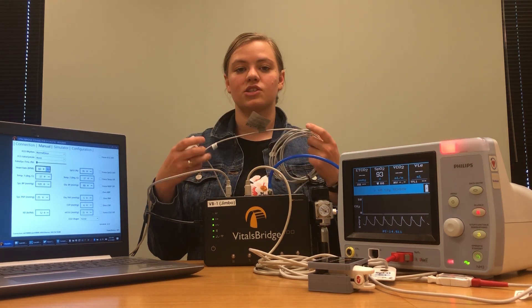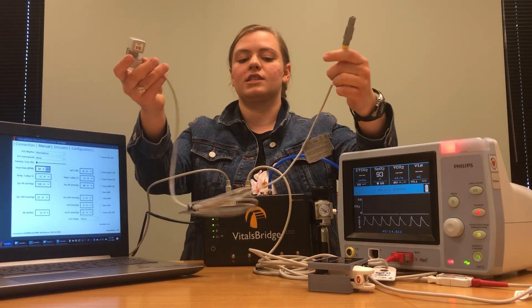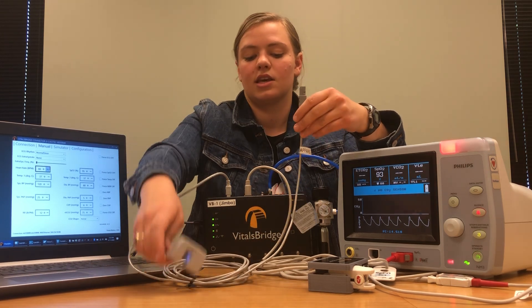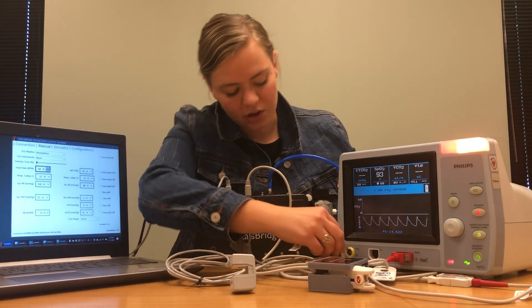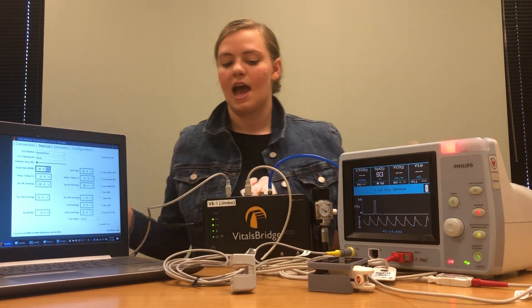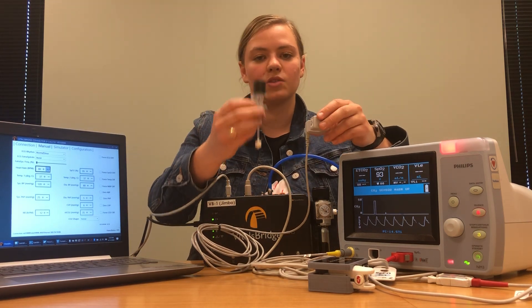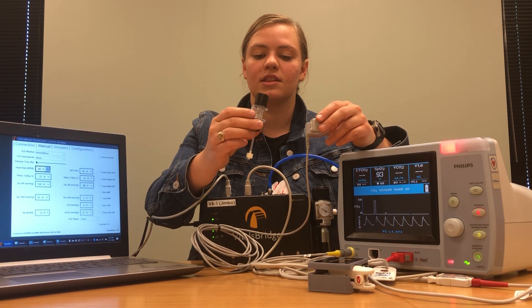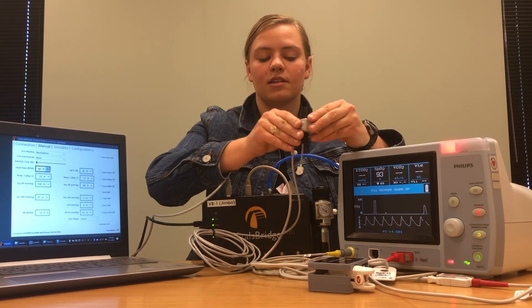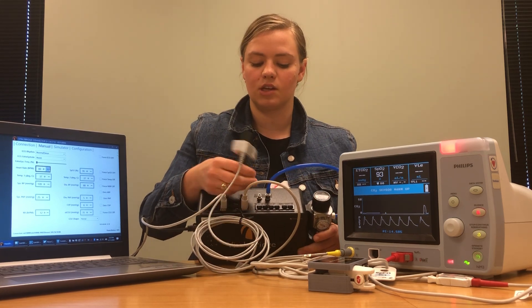The cable that connects to our capnography looks like this. You have one end that goes into the patient monitor and another end that has a little box. The end that goes into the patient monitor is going to slide in right here where it says CO2. Then we're going to take this end with the box and attach the box to an adapter that comes with the VitalsBridge. The adapter looks like this — you'll slide that in and connect this end of the adapter to where it says CO2 out.